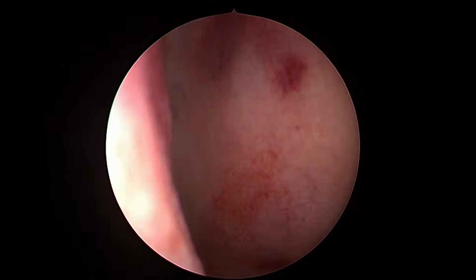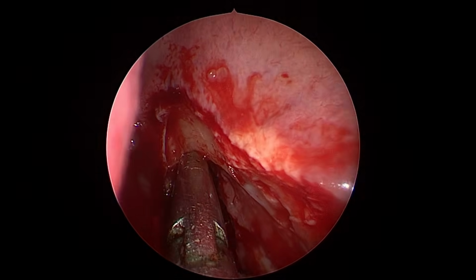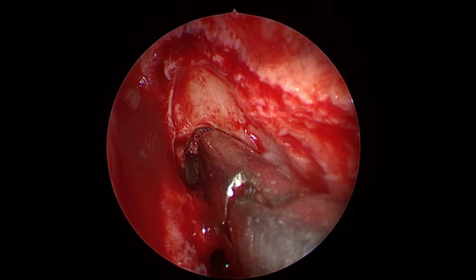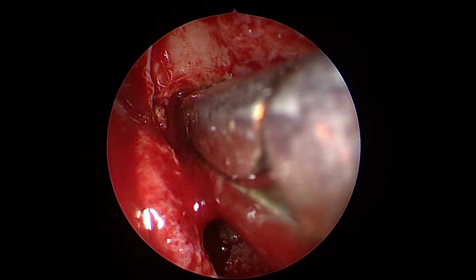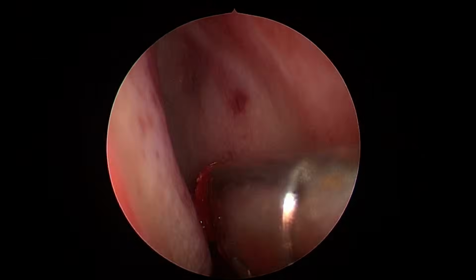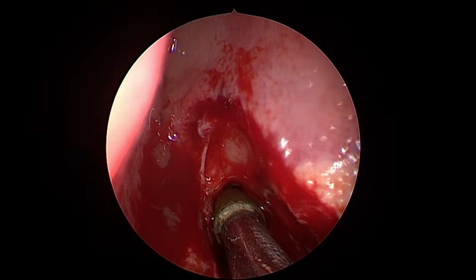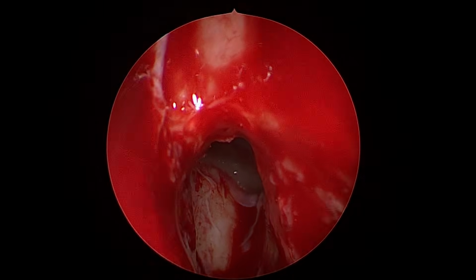So basically, the frontal sinus has to be opened from landmark to landmark, right? Obviously. A lot of people say it should be 6 millimeters. A lot of people say that is nonsense. It depends upon the given anatomy of the patient. You can't dictate in millimeters. The frontal sinus could be very narrow, could be very big. You can open it adequately.